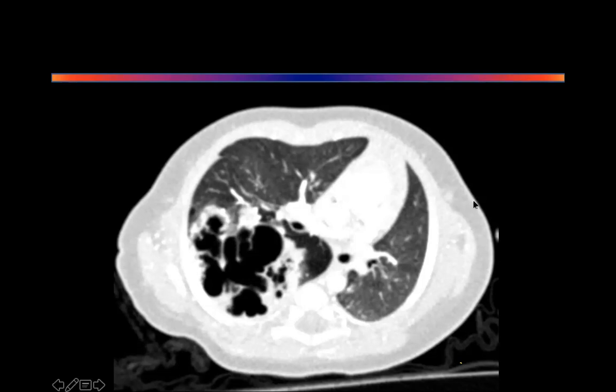So please do not fear the radiology in the exam. All you have to do is just start describing A, B, C, D, E. I showed you what to say: size, shape, consistency, margin, etc. You may not say all of it, but if you say some of it, and you come up with two or three sensible diagnoses, then I'm okay with that. If somebody tells me that this could be a lung cancer, I will not argue with you because who knows, it could be a multicystic lung cancer, possible, but less likely, more likely to be CCAM in a two-year-old child.